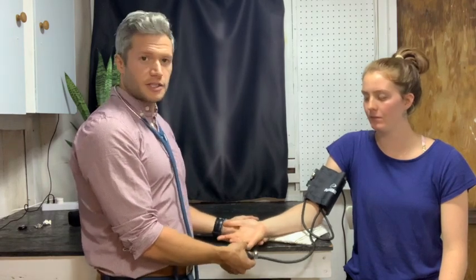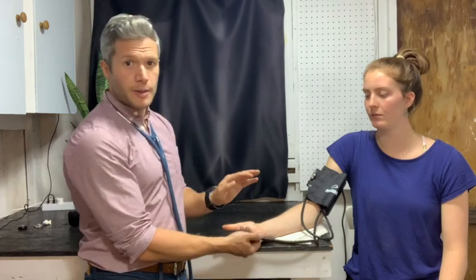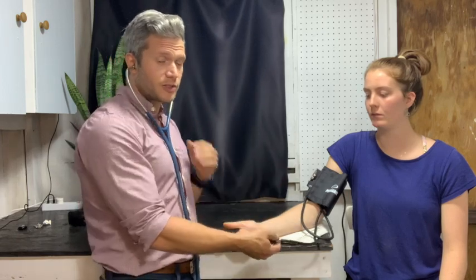Arm is comfortable, good position. Palm up is helpful — if you're in a supine position with the hand, that's great. If you pronate it, you'll find it closes off the elbow a little bit. So we're going to supinate and open up there. I got my bulb set up, the meter for the readings all set up, cuff is in a good position and aligned with the brachial artery. Before I start taking Tully's radial pulse, I'm just going to put my stethoscope in — that's one less thing I have to do when all the parts are moving. People are going to be very varied in how different their systolic and diastolic are, so one of the easiest ways to ensure you're always going to get someone's proper systolic to pump up to is to get the radial pulse.